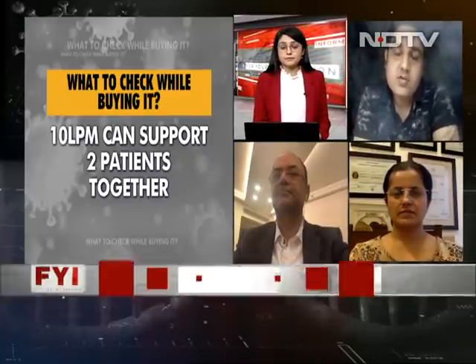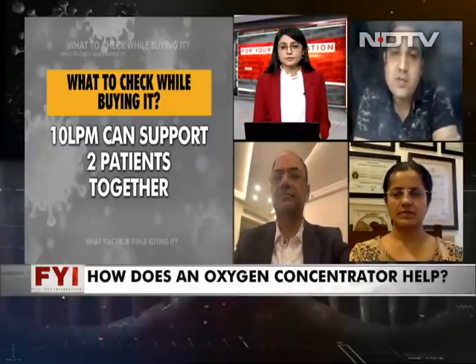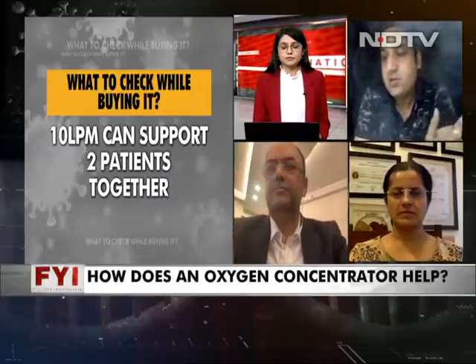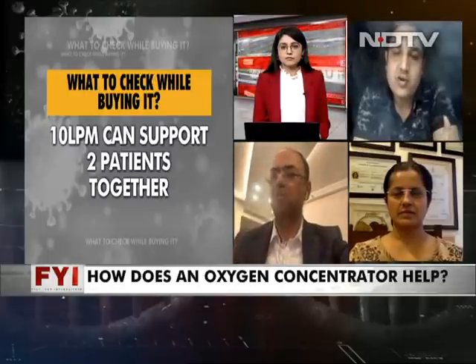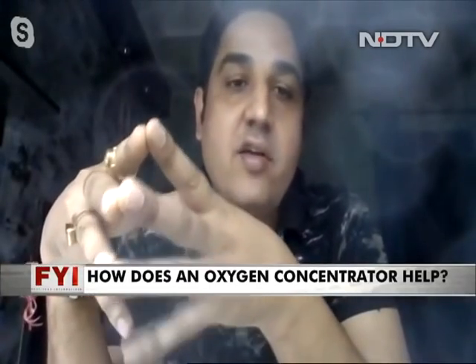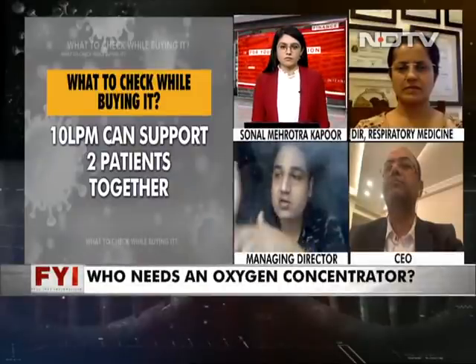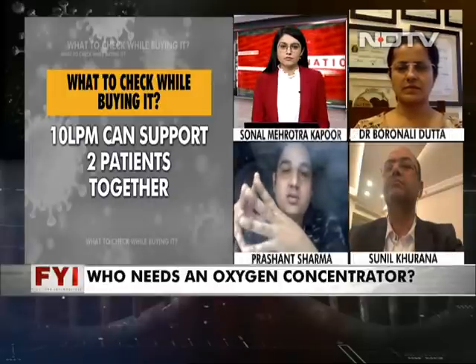Definitely, as Mr. Khurana said, we should buy product from the branded companies, the companies who can provide good after-sales services, who have a good track record in the past. Second thing, when you say fake products available in the market, if we go through the technical literature of these products, we will find that when we use them at a flow rate of 5 liter per minute or 6 liter per minute, the purity goes down and down. So basically these are not medical concentrators.